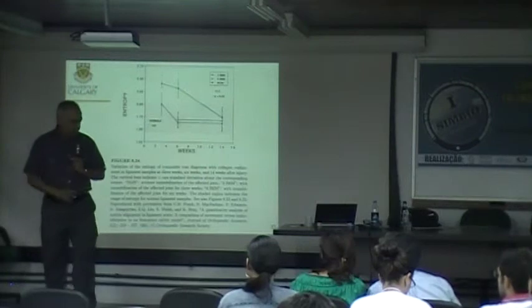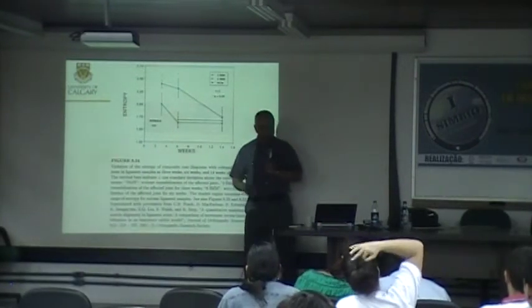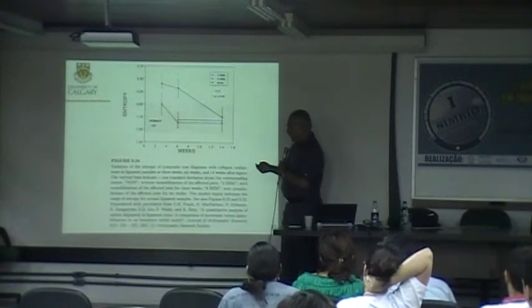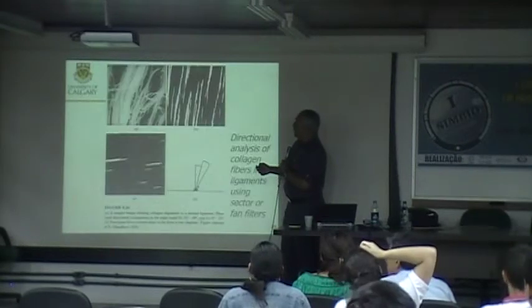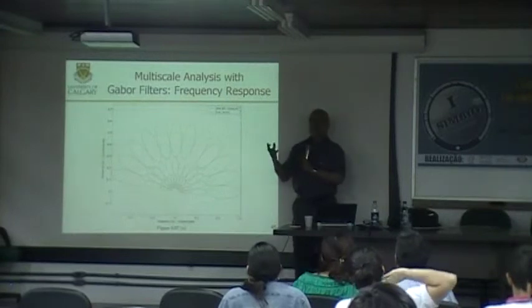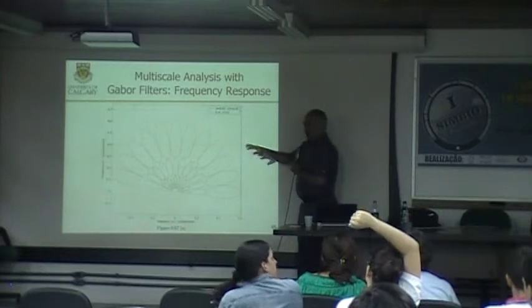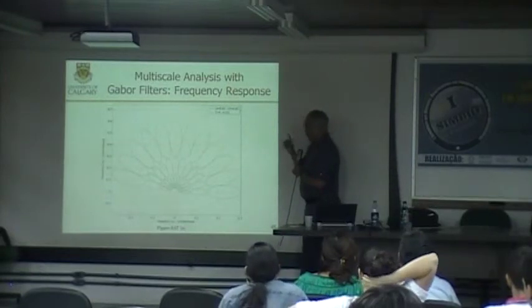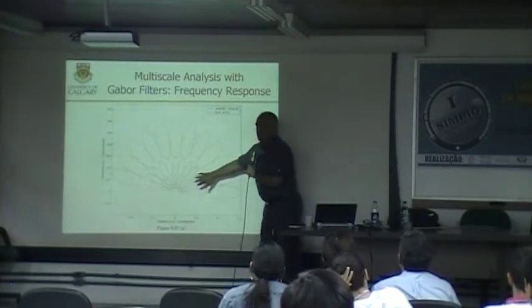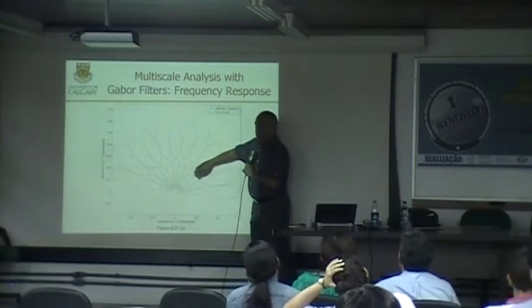So this is important. In a practical application, we need to know where is the information and where is noise, or where is irrelevant detail. So it is good if we can build this into the filtering procedure and feature extraction procedure. For example, with Gabor filters, for analysis of asymmetry, we use multiple scales. For the analysis of architectural distortion, we use only one scale.